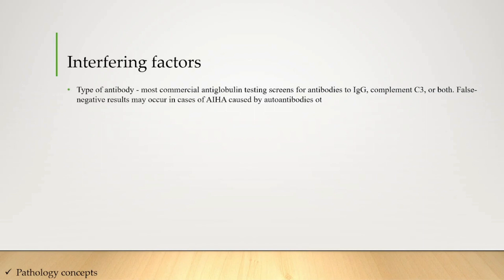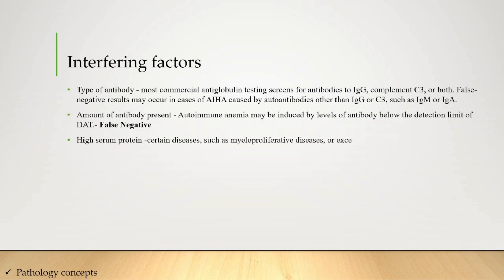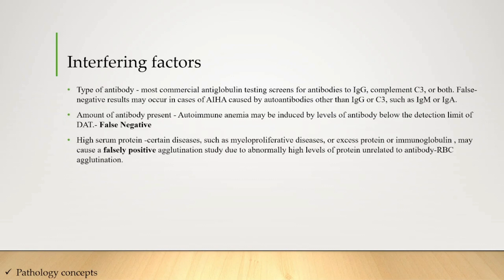Let's understand the interfering factors. First, the type of antibody: most commercial anti-globulin testing screens for antibodies to IgG, complement C3, or both. False negative results may occur in cases of immune hemolytic anemia caused by autoantibodies other than IgG or C3, such as IgM or IgA. Second, the amount of antibody: autoimmune anemia may be induced by levels of antibody below the detection limit of the DAT, giving a false negative. Third, high serum protein: in diseases such as myeloproliferative disease, excess protein or immunoglobulin may cause false positive agglutination due to abnormally high protein levels related to antibody RBC agglutination.